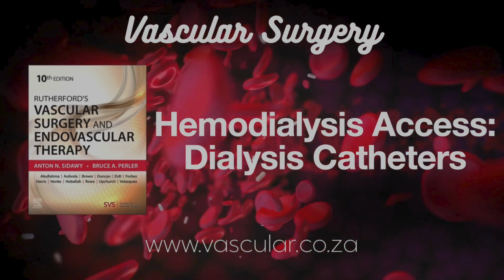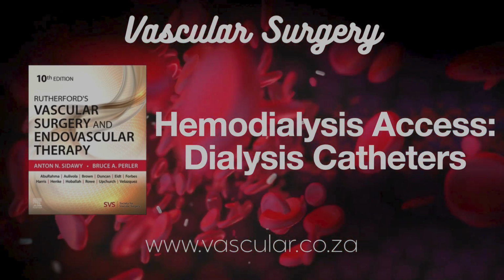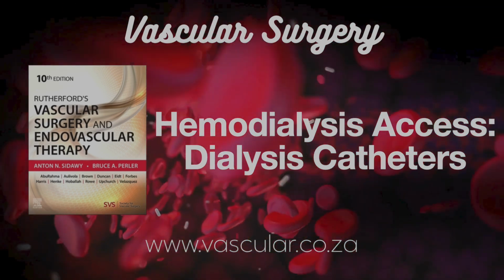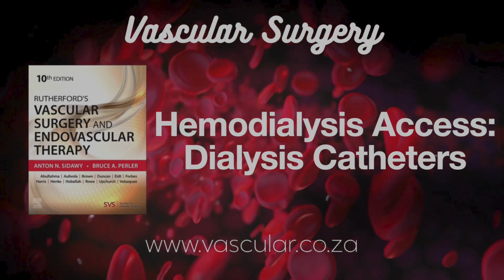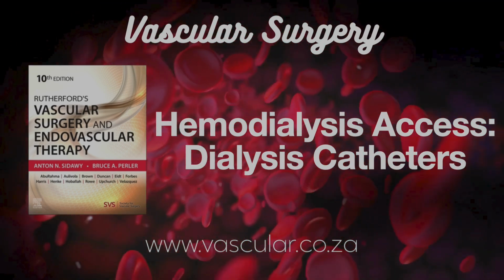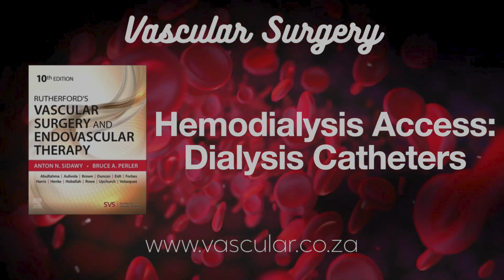And what is that gold standard? You mentioned it. That would be catheter-based contrast venography. So actually putting a catheter in and injecting dye, when is that done preoperatively? It's usually reserved for cases where we strongly suspect a significant blockage based on the history, exam, or the other imaging. The big advantage is if we find a narrowing during the venogram, we can often treat it right then and there, maybe with balloon angioplasty or a stent. Ah, diagnostic and potentially therapeutic in one go. Exactly. Plus, it often uses less contrast dye overall than a CTV, which is a bonus for the kidneys.